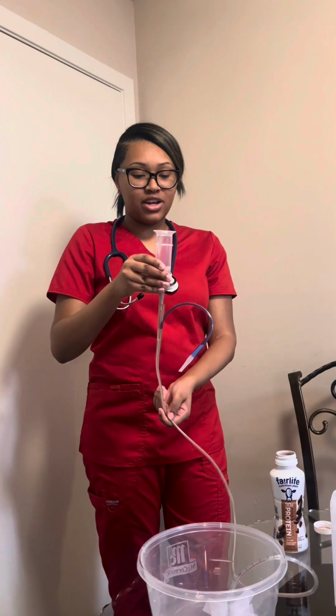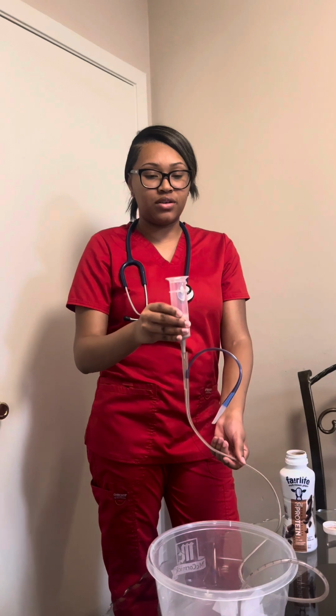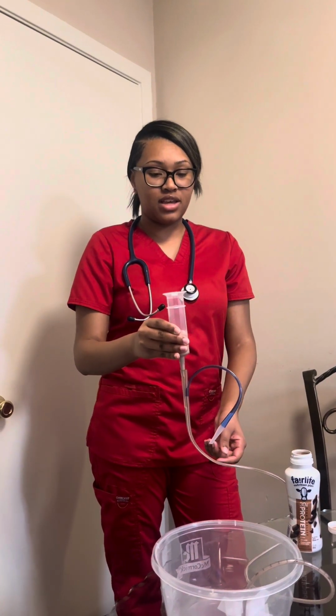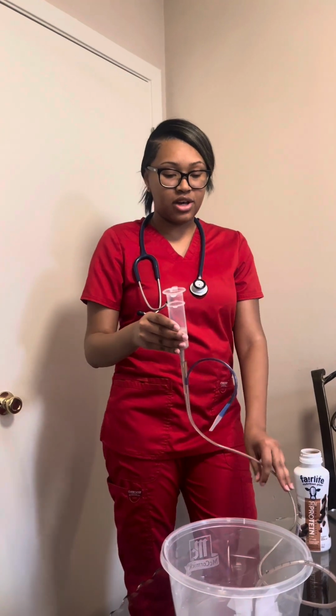And I would not put it more than 15 to 18 inches above the insertion site of the tubing. And I would just let that flow in.